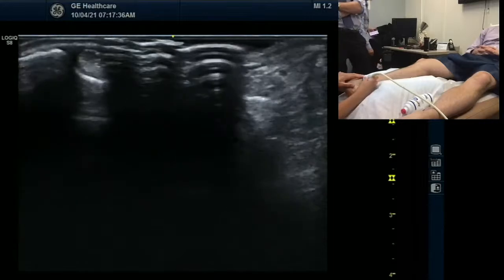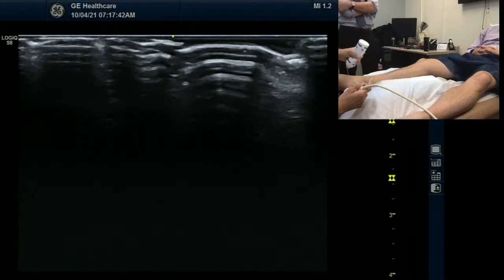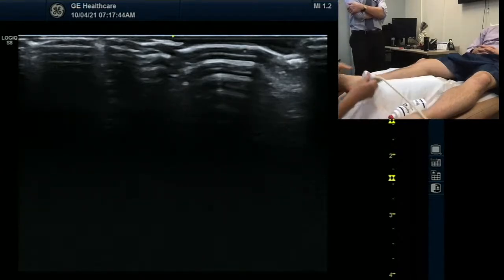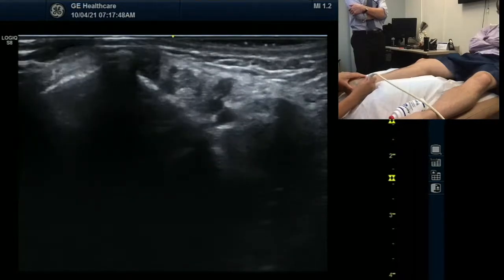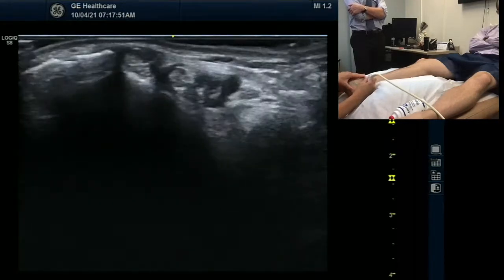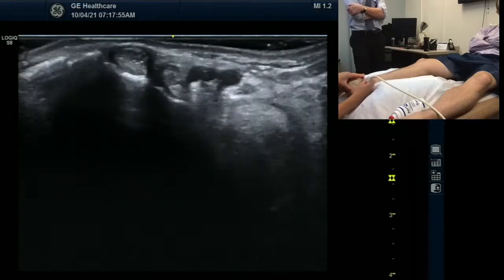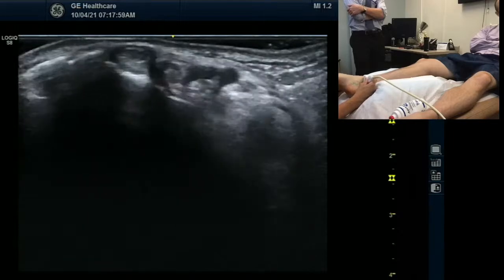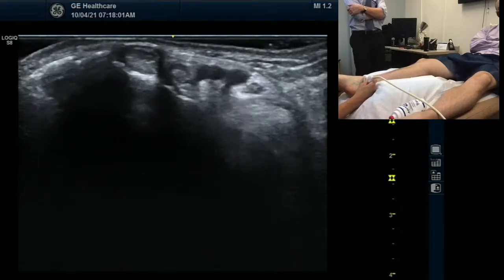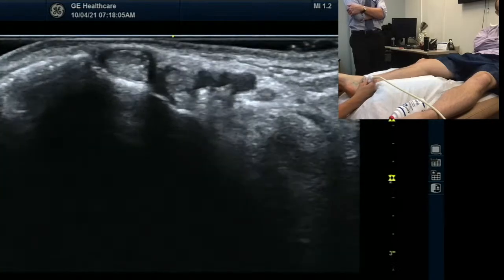Put more gel. The funny thing is that we have to really... This is more of a 'we're all learning together' situation. Can you narrate what you're seeing John? So I have the classic posterior tibialis. Flexor digitorum longus. Flexor hallucis longus now. See, look how beautiful it is for the linear probe — you can see it really classic. So flexor hallucis longus is on the bottom right of the screen.